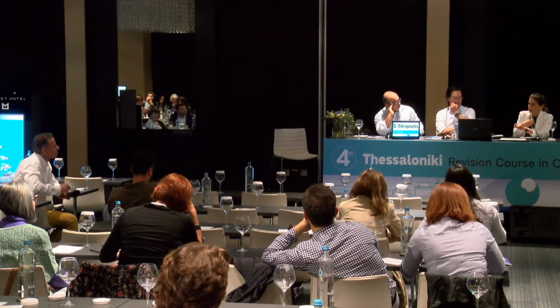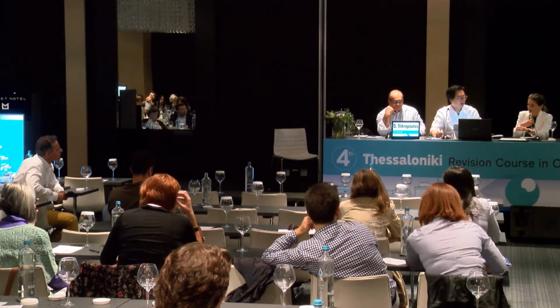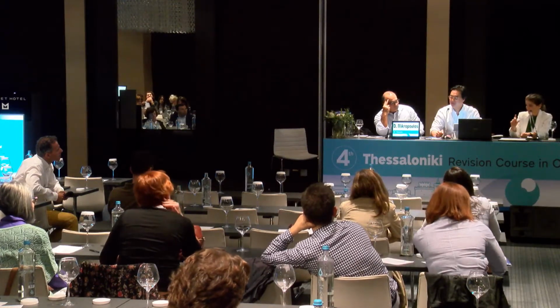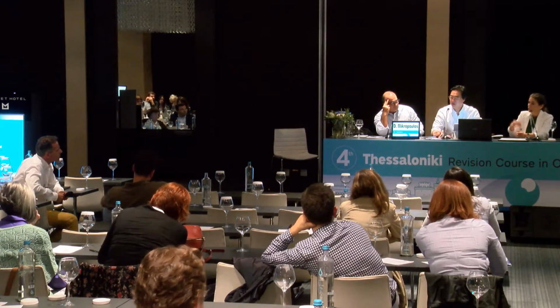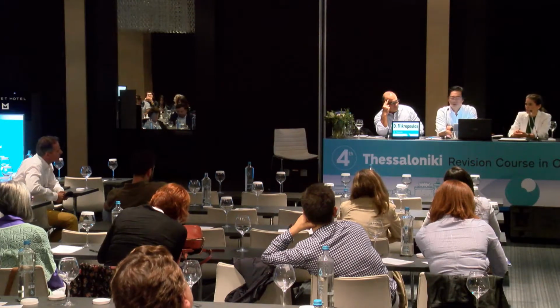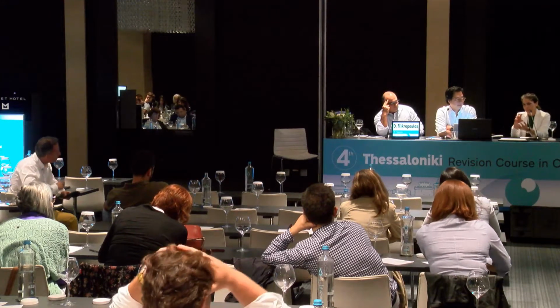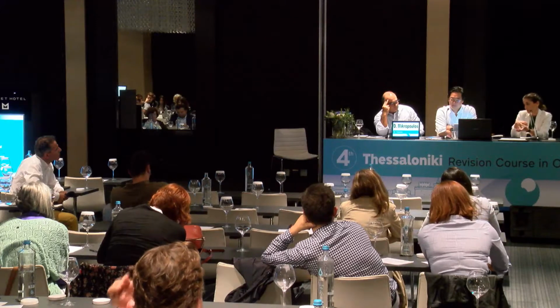But for these patients, I also do the visual field as well. So for these patients, I would like visual field and retinal nerve fiber layer OCT, if they don't have huge dysplastic changes like staphylomas, and if they do, I will rely on the macular changes. But even non-glaucoma patients can have some defects which do not change over time, and that needs to be taken into consideration. But I must admit, I have a low threshold for treating.